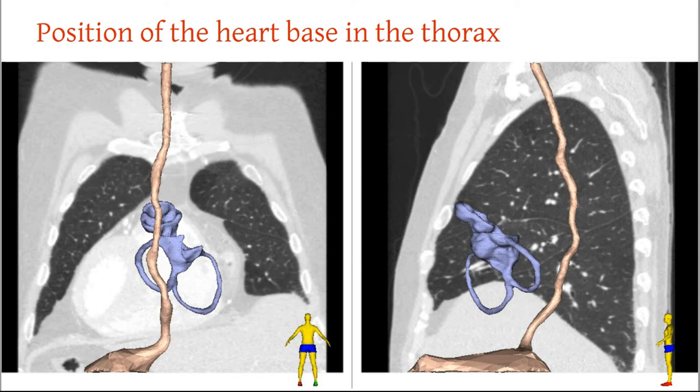And you can see again, at about 0 degrees, you're going to go through the interatrial septum, the mitral valve, and the tricuspid valve. And you can actually see why in many patients, to get the proper four chamber is not quite at zero. Sometimes you have to add about 10 degrees or so. And this patient kind of illustrates why that happens often.